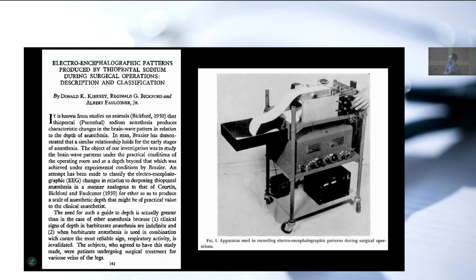So back in the 1950s, EEG was invented in the late 20s, like 1929, Hans Berger. So already by the 1950s, people are using EEG to kind of look at stuff because there were not that many tools back then. We didn't have pulse oximetry, we didn't have agent gas monitoring, we didn't have blood gas monitoring because we didn't have cheap tools. Those things were all time-consuming tests you would do in labs, maybe one sample at a time. You couldn't have anything continuously. So EEG was a continuous tool. So people were very excited about this.